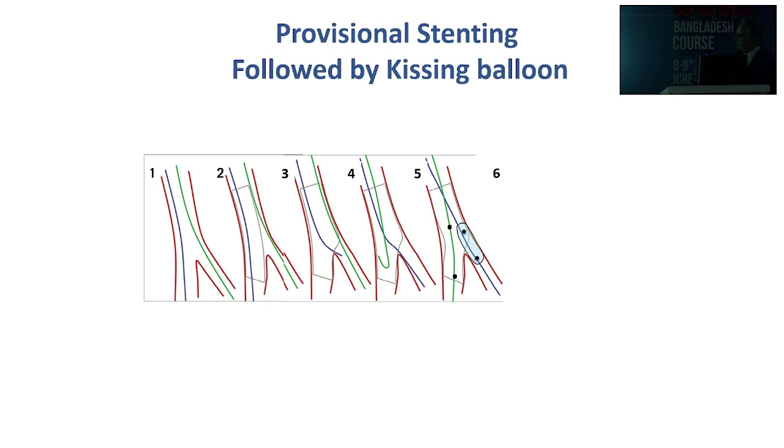The carina is shifted to this side, so the stent is not well apposed and not well deployed here, and the likelihood that you needed to do that to improve access in the future is probably none, because you already accessed it. If you accessed it today, you're going to be able to access it tomorrow. So this is not an appropriate technique, to open up the strut with a simple balloon in the side branch. If you do that, you do have to finish with a kissing after that.